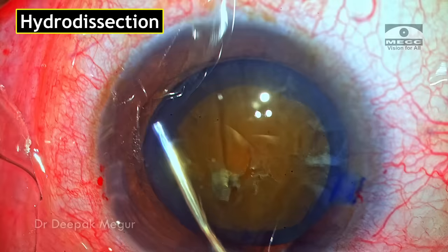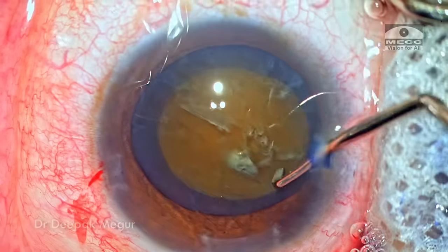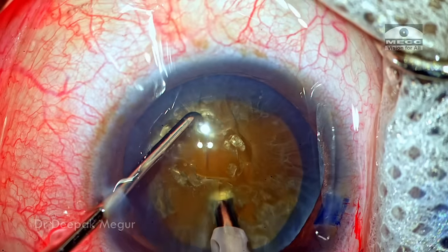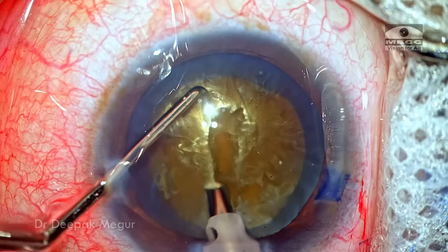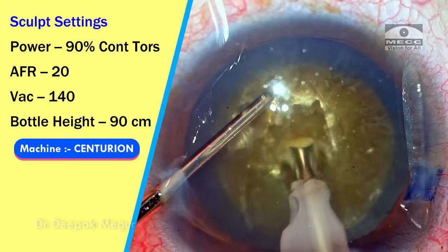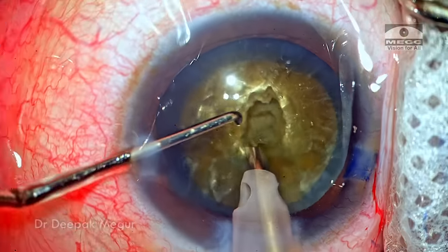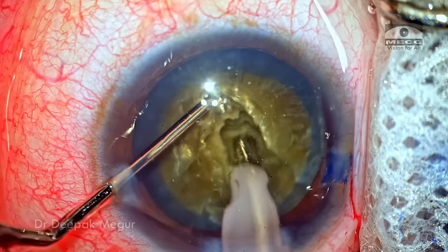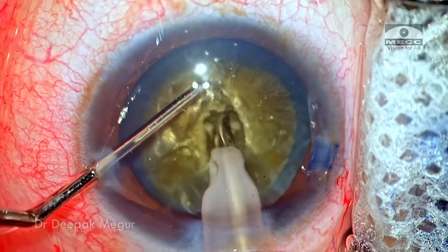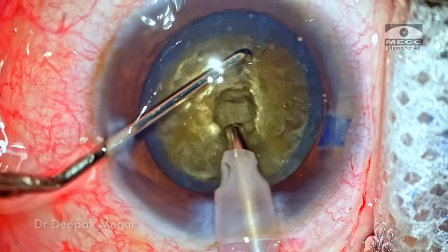The biggest challenge now is to divide this nucleus into smaller fragments. As is customary for me in these dense cataracts, my standard go-to technique is to do a central trench or create a small central pit, which gives me access to the central core of the nucleus so I can then do my vertical chopping. For this trench I'm going to use continuous torsional energy for sculpting out the central part of the nucleus — about 3 mm in diameter and around 60% depth.